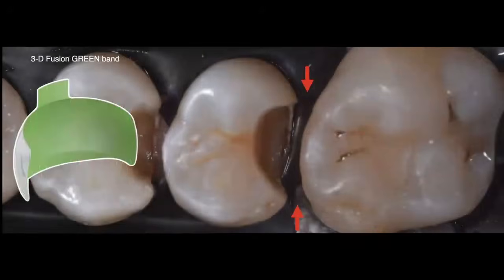Now this is not a back-to-back case. Yes, this is a deep proximal box. It's a wide box as well, but you can see that there's ideal or good proximity between this tooth and the tooth distal to it. So I don't have a large interproximal space.